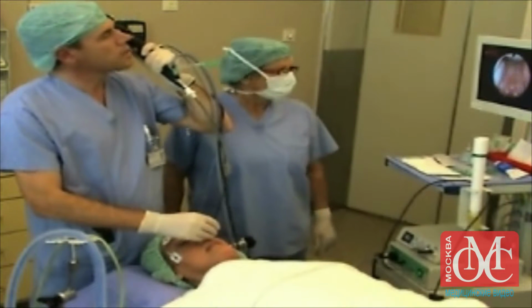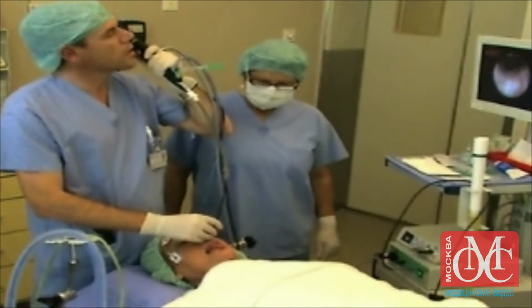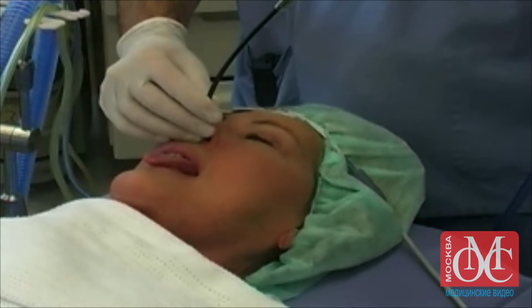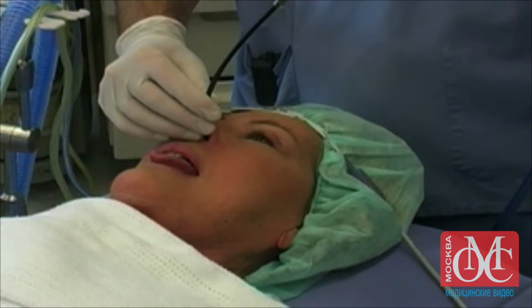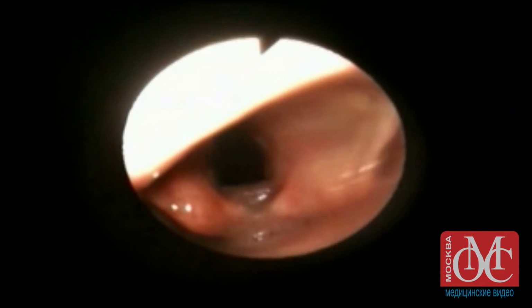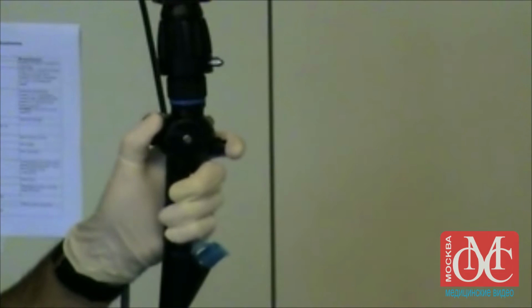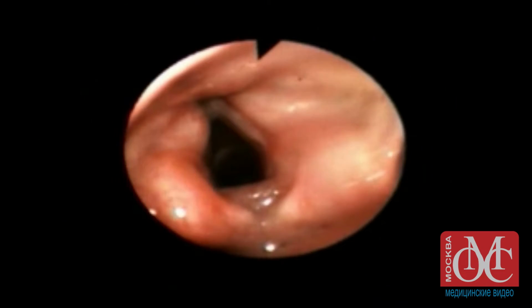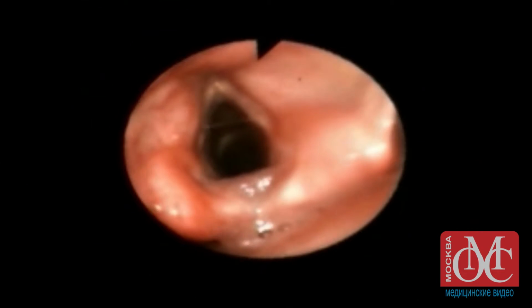When you reach the posterior nasopharynx, ask the conscious patient to stick out her tongue. This maneuver makes it easier to advance the instrument towards the epiglottis. Simultaneously, lift the tip of the fiberscope, making a slight downward movement with the thumb of the hand that is holding the instrument. If a patient is heavily sedated, a tongue traction maneuver is helpful.